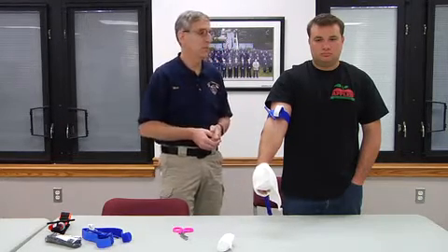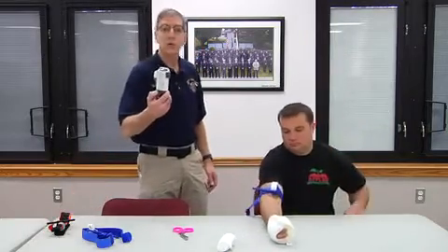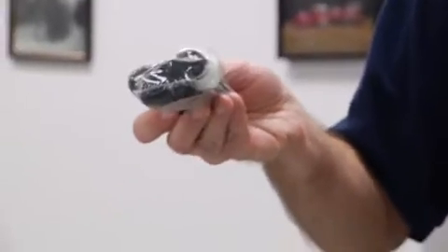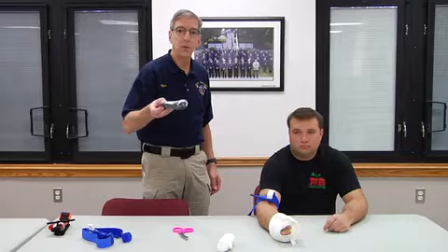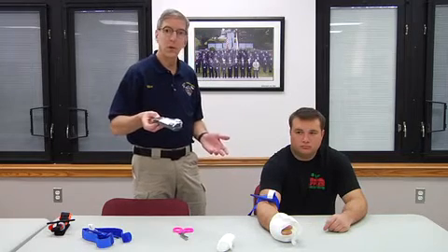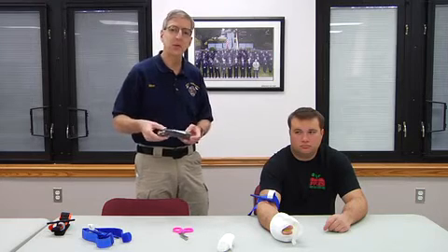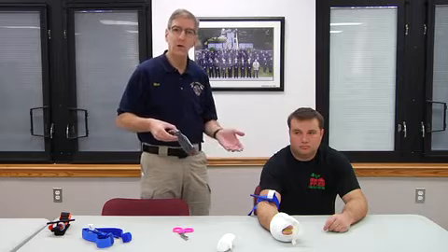A couple other things about tourniquets. You could sit down. Check your tourniquets in your bags. If you have tourniquets that are wrapped like this tourniquet is, that's not a useful tourniquet in an emergency. You just saw somebody try to apply a tourniquet with a single hand. If he had to unpackage this tourniquet and get it ready to use, the delay could cost his life.